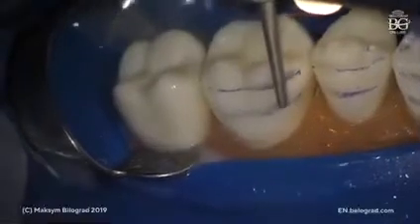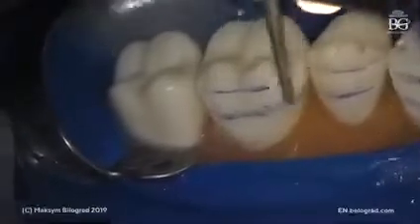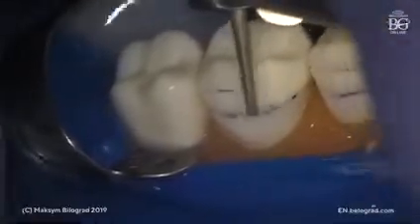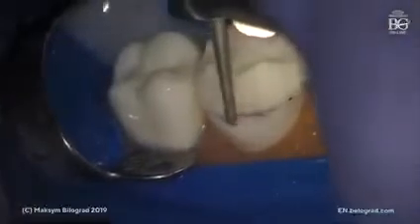So we prep incisal plane, and see that I'm prolongating my burr to mesial part of the tooth. That will help to mask transition between veneer and the tooth surface. Okay, so this is the angle of incisal plane. We did preparation. Then we keep our burr parallel to the middle plane.